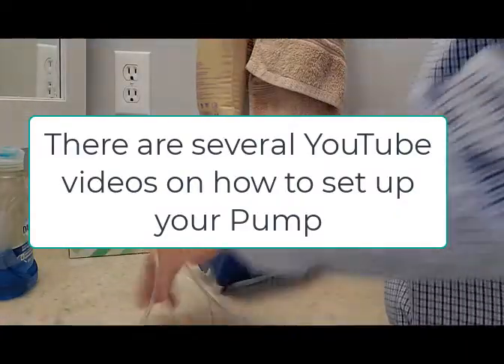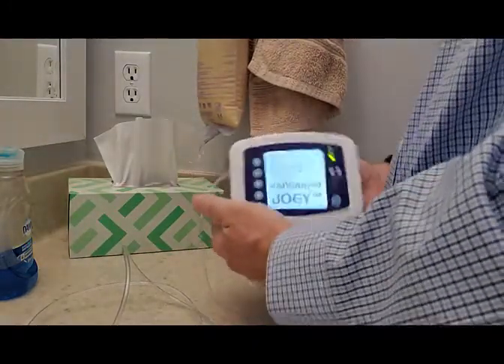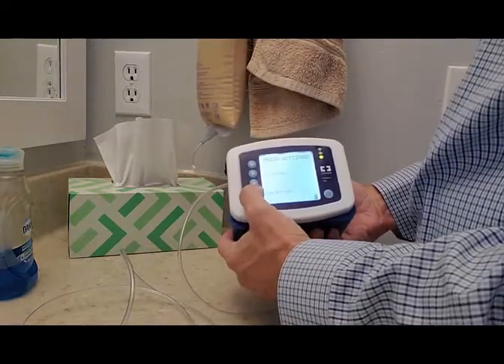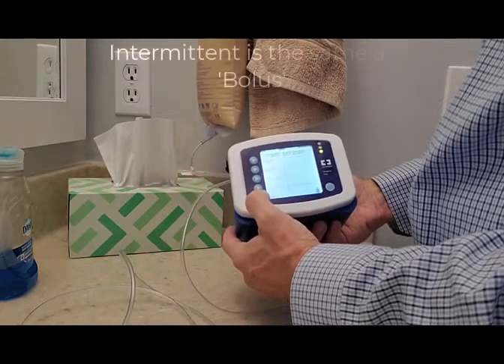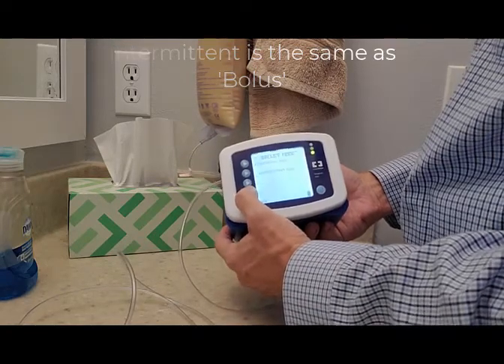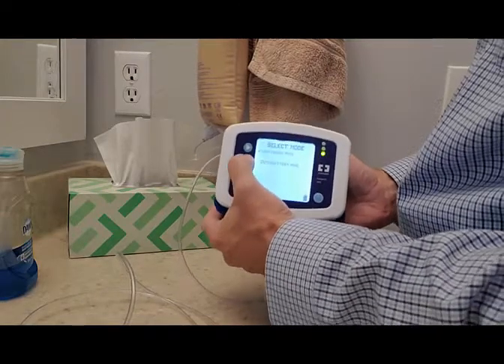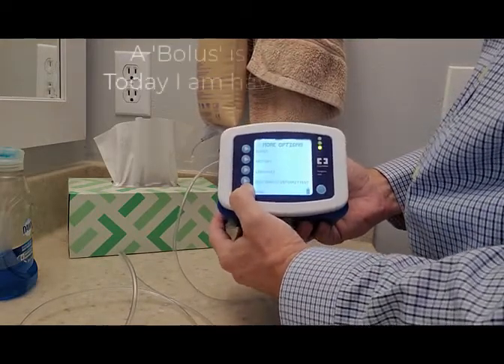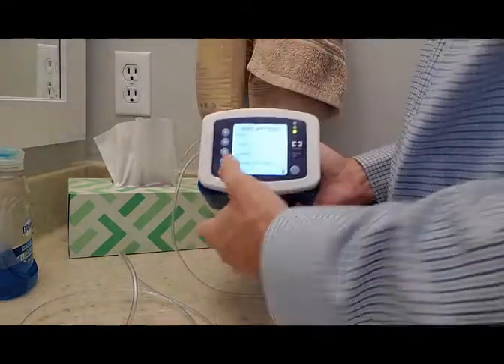What I'm doing here is I'm just trying to demonstrate that when you are ready, you have to make a choice. You have to choose between bolus or intermittent or continuous. And continuous means always flowing. When it's on, it's always flowing. And I tend to do bolus. It's like a meal. I'll do three of them in a day.